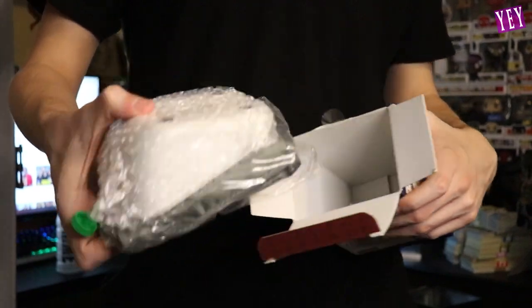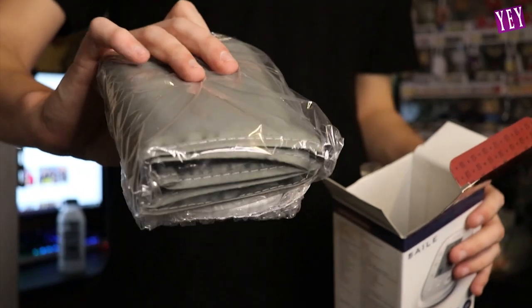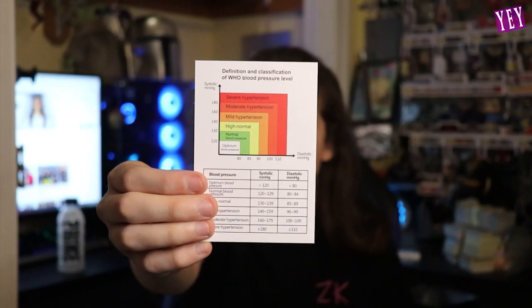Whoa, it's so small and compact. That was the device itself. It also comes with the user manual and a little blood pressure measuring gauge. This tells you if your blood pressure is bad or good — that graph right there will help you with it.